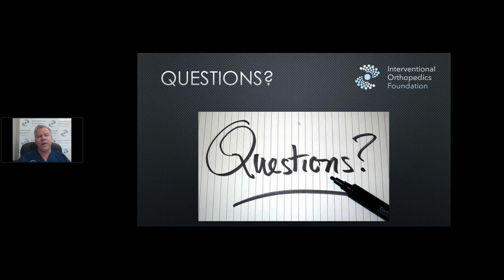Alariza, what is the preferred lumbar MRI protocol in respect to slice thickness, gap, and axial and sagittal planes, 2 millimeters, to accurately evaluate discs and all these other things? Yeah, Alariza, normally these are 3 millimeter slices. It's certainly possible to get them thinner.